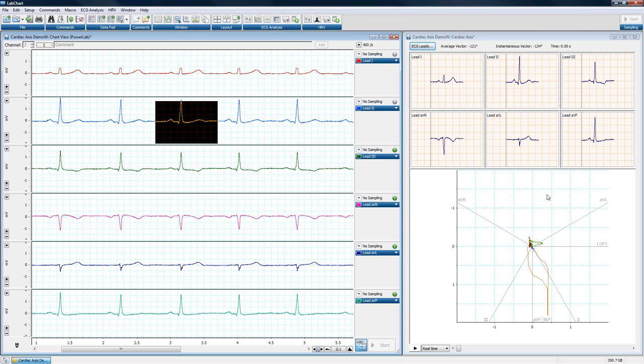What does this do for us? We can show the cardiac vector as it changes, and we have a bunch of different speeds we can do here through this beat. So if I hit this, we're in real time, we can't really see it very well, so I'm going to slow it down here, and I'm going to go slow. I'm going to hit add.